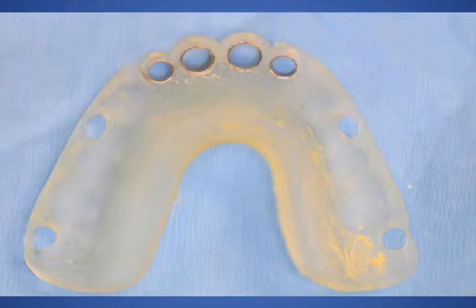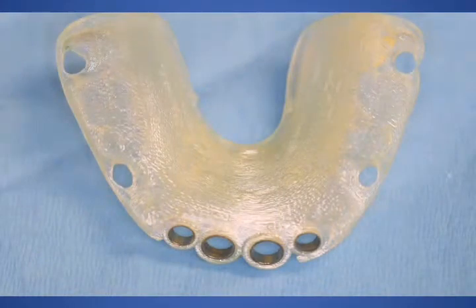We fabricate a surgical guide based on the CT diagnostics of the Nobel Guide scanning software. The laboratory is able to stabilize the 4 rings, which are surgical guide rings, quite nicely. But you can see there's no set pins to hold this appliance in place. It's more like a precision occlusal guard that will allow us stability and allow us to use the rings in the surgical placement of our dental implants. Here's an occlusal view of the same.